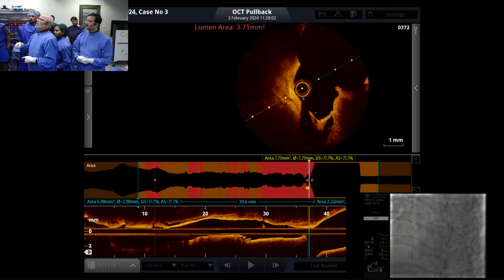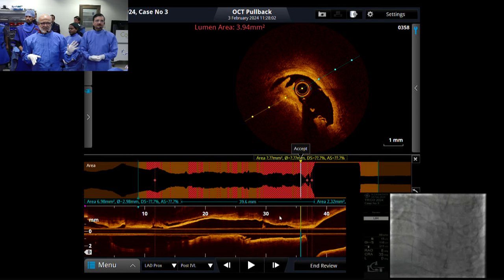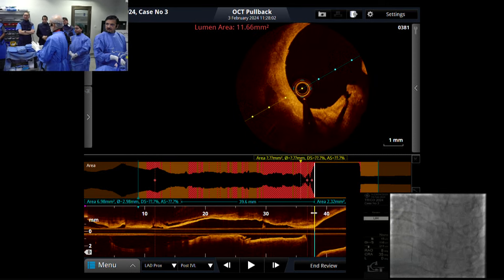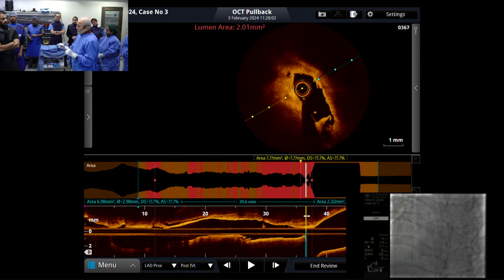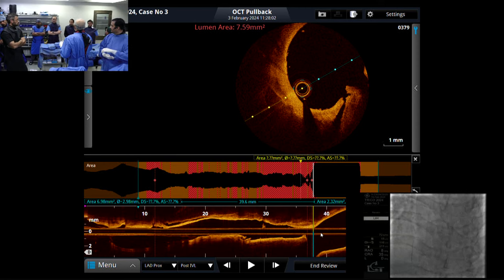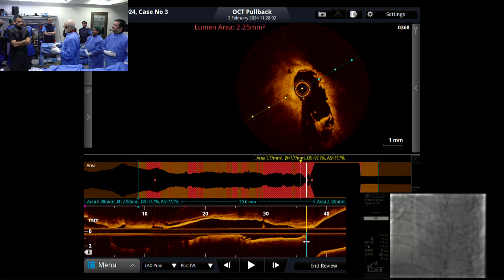Proximal is difficult to identify. We'll have to come all the way to the ostium, right? Right. I am not going to take it as a left main bifurcation. And neither am I going to keep the wire in the circumflex because it's a big circumflex and the ostium is also good and there is a reasonable angle, and a couple of millimeters of stent protruding inside is not going to create any problem in this big artery. What do you think? Because we have done this all the time in carotid. True. From internal carotid to common carotid, even bigger length.